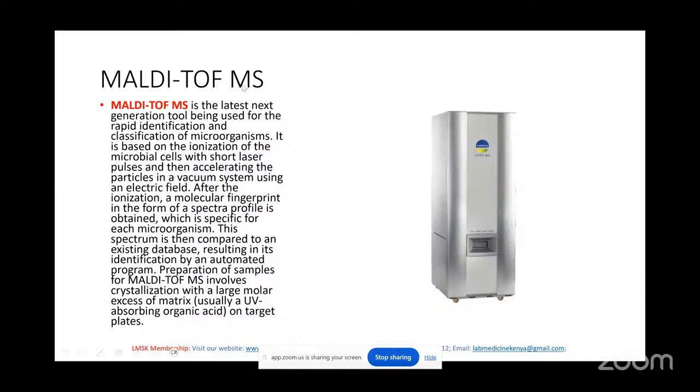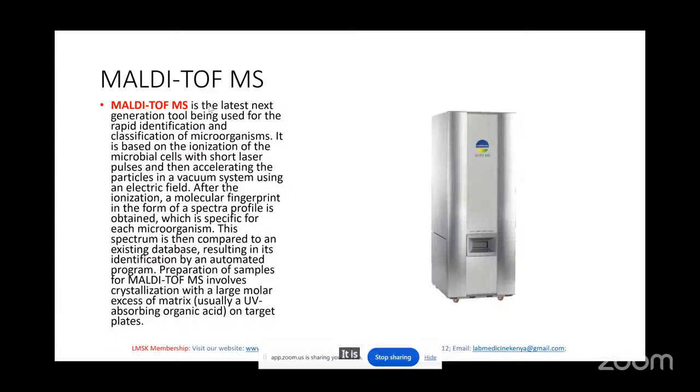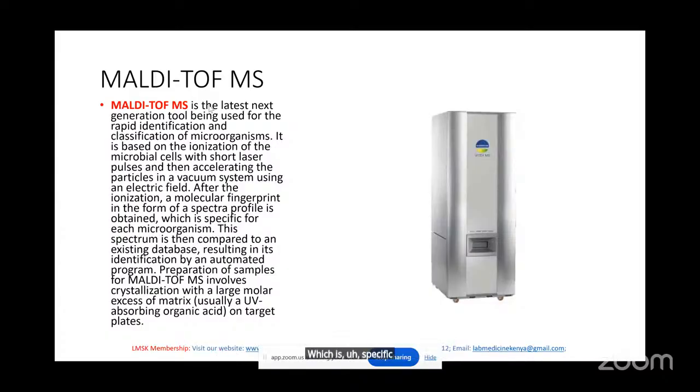So MALDI-TOF MS is the latest next generation tool being used for the rapid identification and classification of microorganisms. It is based on the ionization of the microbial cells with short laser pulses, and then accelerating the particles in a vacuum system using an electric field. After the ionization, a molecular fingerprint in the form of a spectra profile is obtained, which is specific for each microorganism.